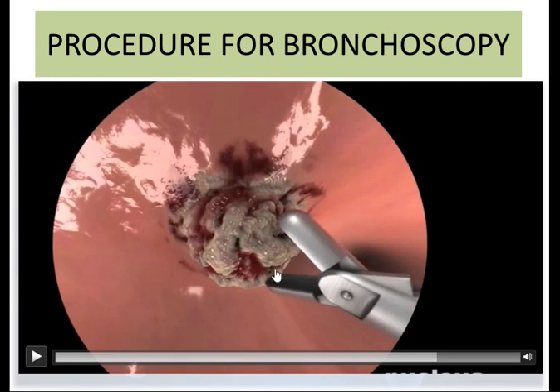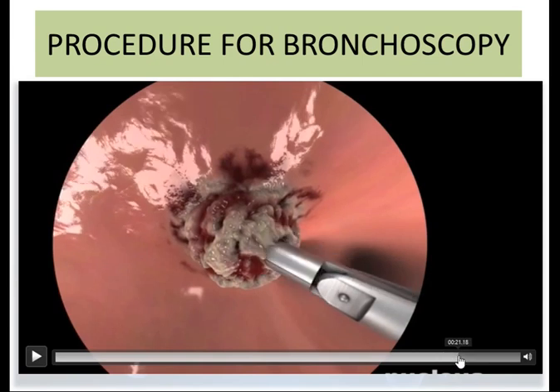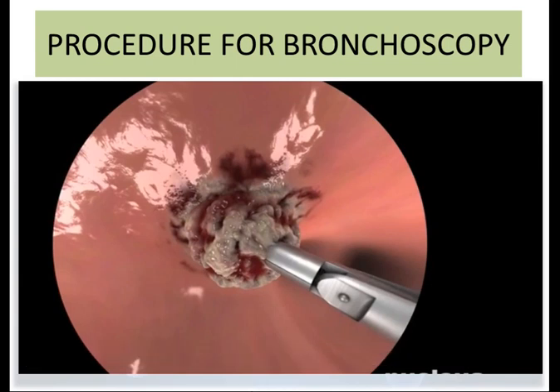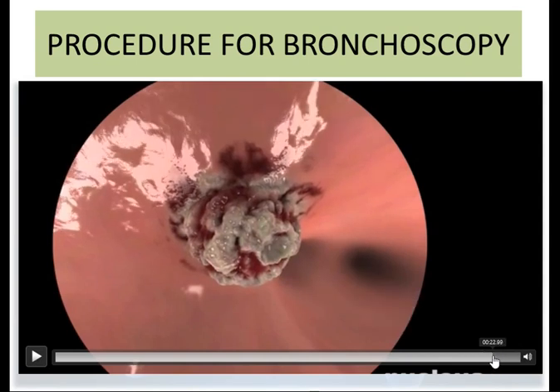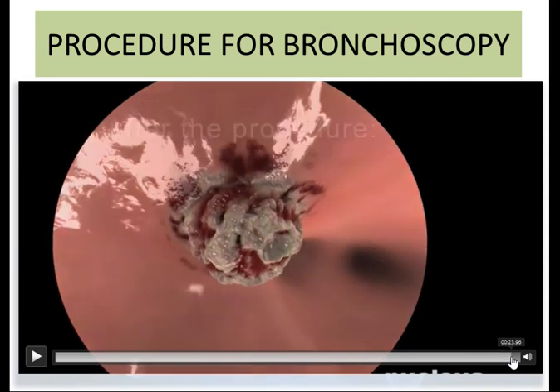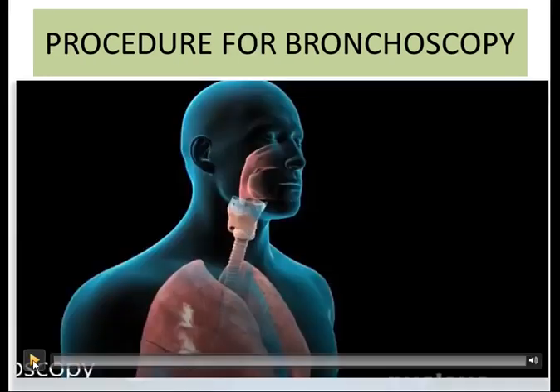The tongs of the forceps are now widened. This forcep will move farther into the mass — it has moved and has collected a part of the tissue of this abnormal growth. It is now leaving this space. The entire bronchoscope would now be retracted back out of the respiratory system. Since we have seen the process step-by-step, the video is now played in a continuous format so that you can see what actually goes on during the process of bronchoscopy.